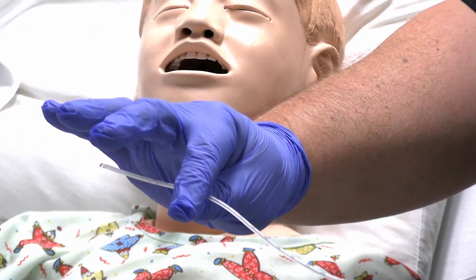Because we have a 4.5 tracheostomy tube, just like with your endotracheal tubes, you want to double the size of the endotracheal tube or the trach tube in order to select your catheter size for suctioning. So with the 4.5 you can use either an 8 or a 10 French catheter. Keep that in mind as a rule of thumb when selecting your catheter.